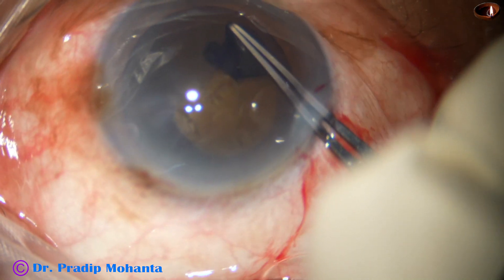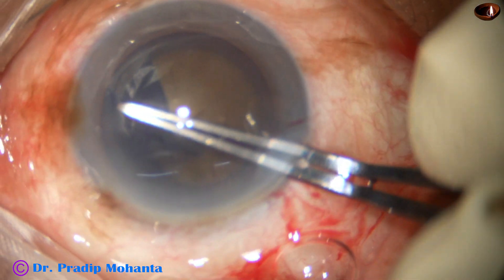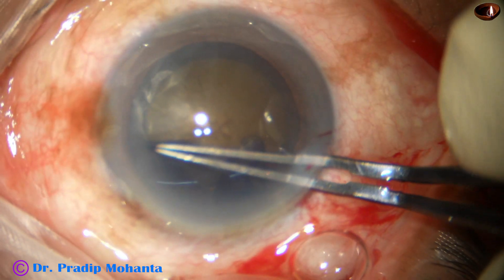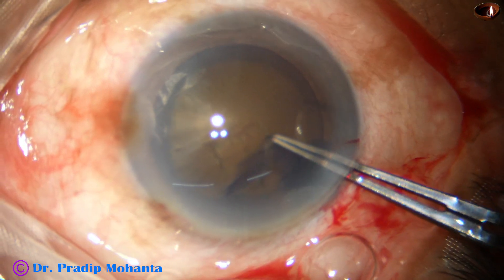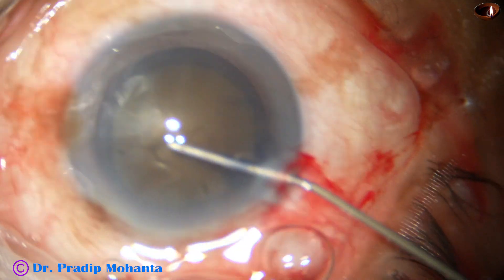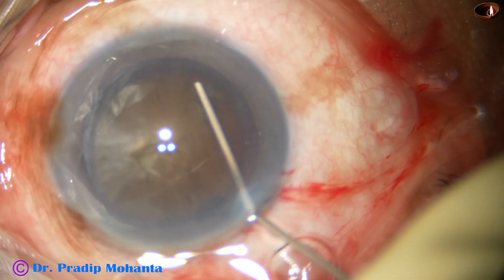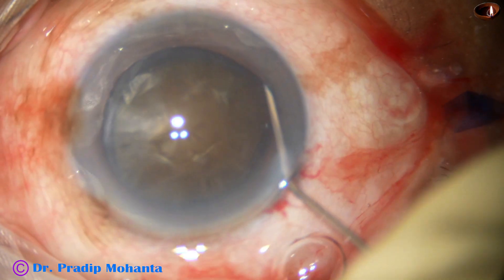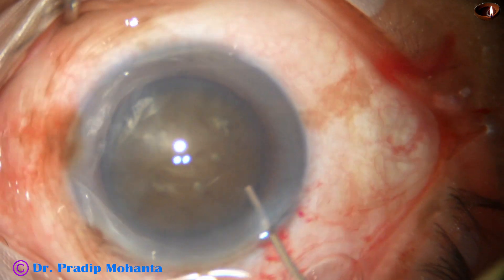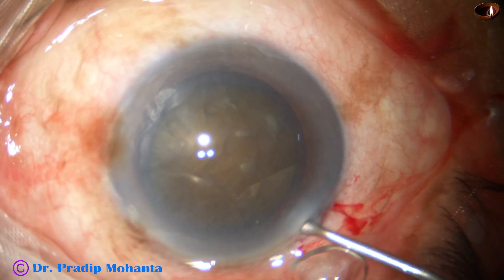Still, I have to do a large rhexis, though I know that if I go to the periphery and include the zonule, it will be very tough. I did a large rhexis and at 2 o'clock I went to the periphery a bit to make it a kind of oval rhexis. This means the 2 o'clock to 8 o'clock axis is longer than the 11 to 5 o'clock axis.